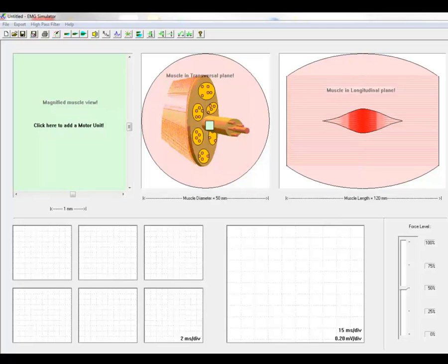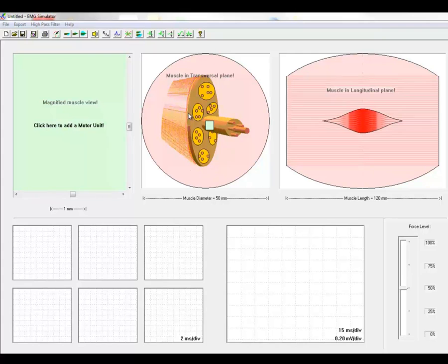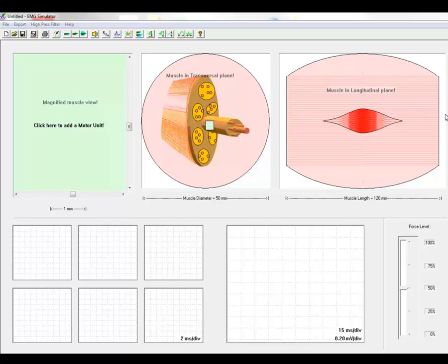This will be a demonstration of the relationship between a motor unit potential and muscle fibers and motor unit properties by using an EMG simulator. This is the cross section of a muscle and this is a longitudinal section with the motor end plates placed in the center in a motor end plate zone.